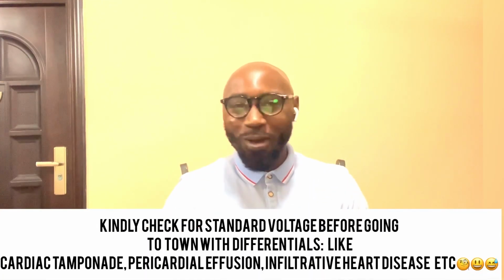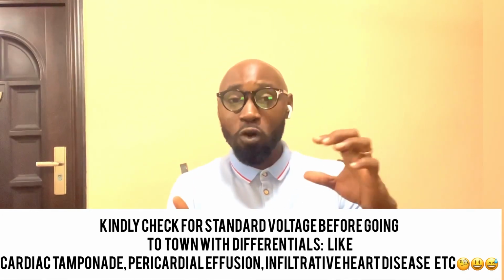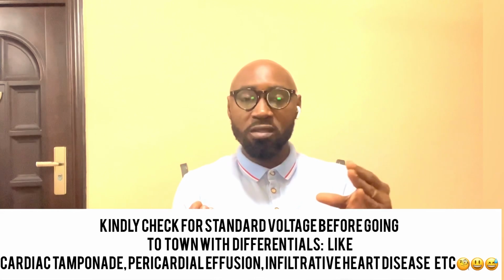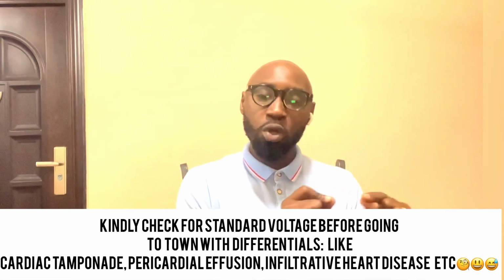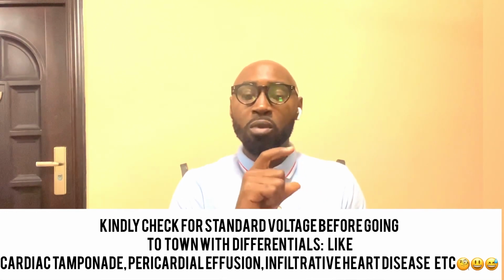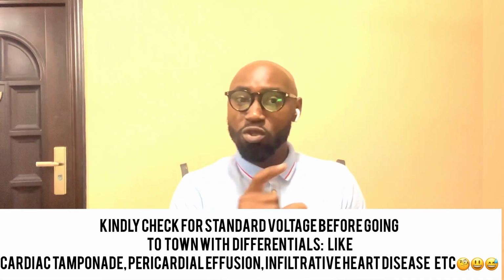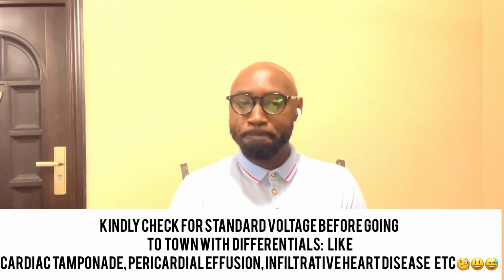And at this point, before we even start considering sinister causes, serious causes of short waveforms, say short QRS complexes on an ECG tracing, it is important to ensure that the standard of 10 millimeters to 1 millivolt is being used. If not, then the interpretation should be done with that consideration.